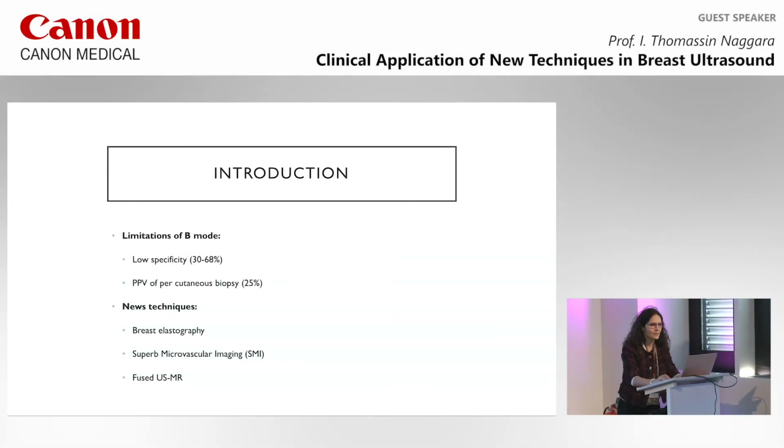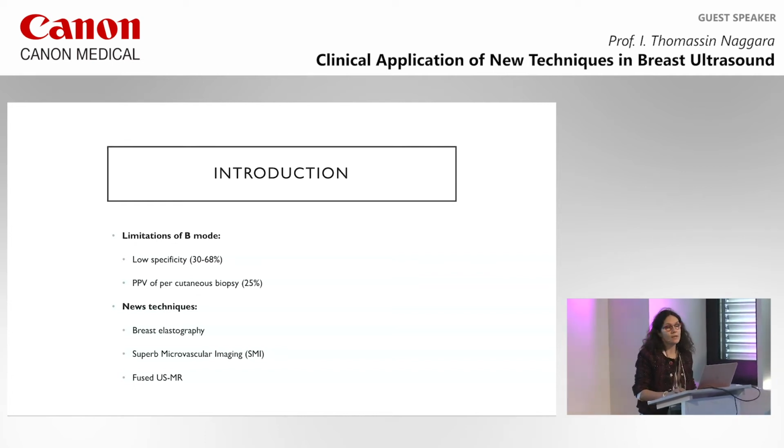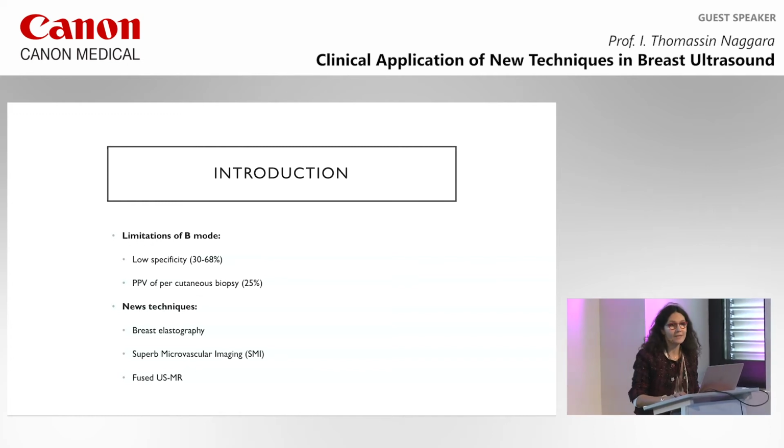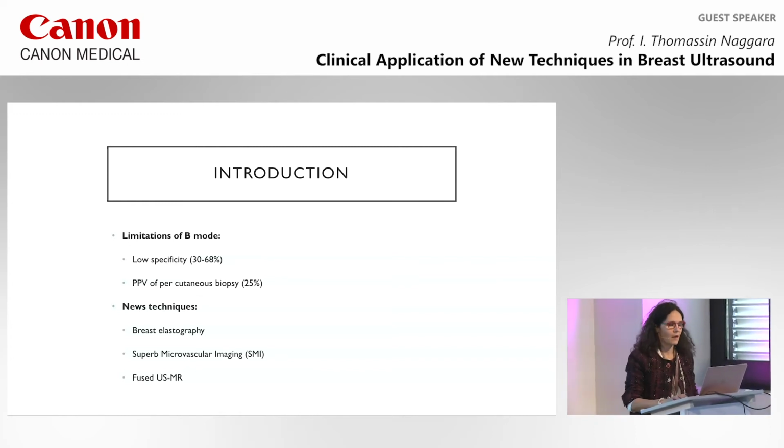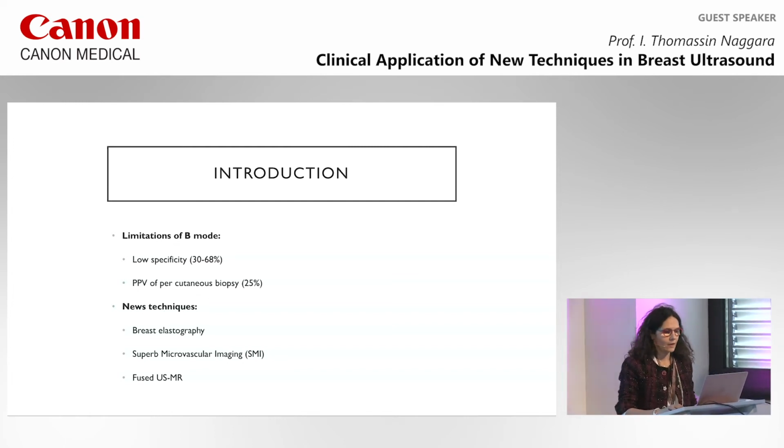In this lecture, I will show you new techniques, because we know that on B mode we sometimes have low specificity and we would really make biopsies for malignant lesions. So we want to improve our positive predictive value of malignancy. And I will show you three new techniques.